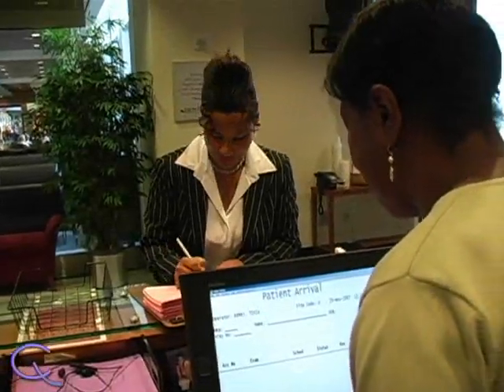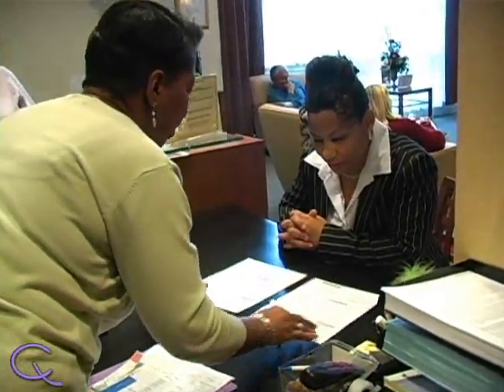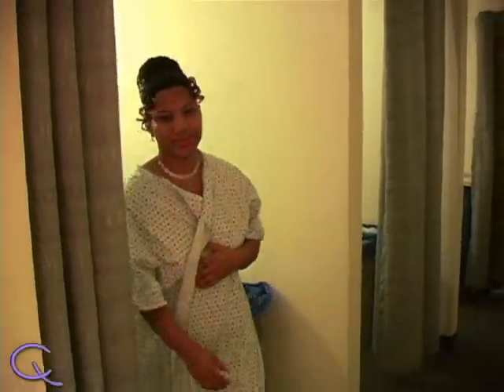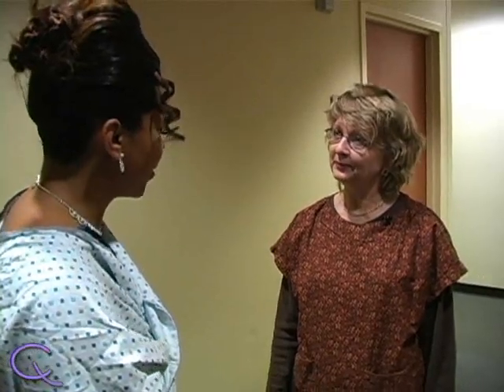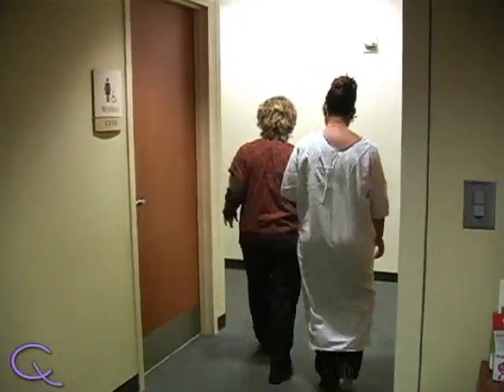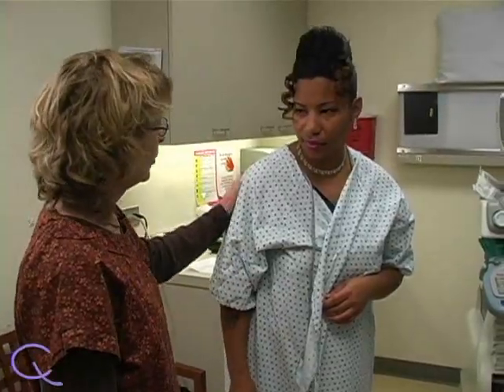Ultrasound is a very safe exam that requires no special preparation — you can begin your day as you would any other. Once you arrive at the exam center, you may be asked to put on a gown that allows the technologist easier access to the area of interest. You may also need to fill out forms about your family's medical history, and you should definitely inform the technologist regarding any previous imaging tests, areas of pain, or concern.